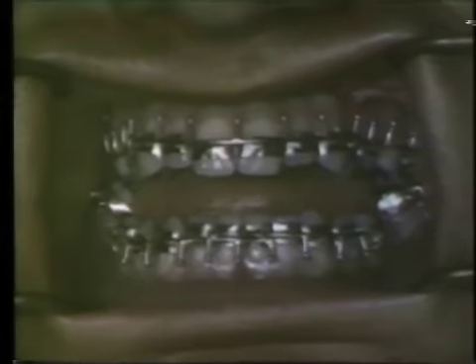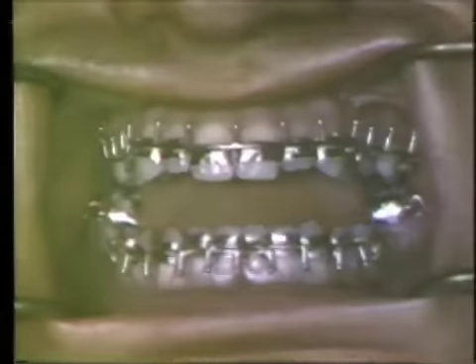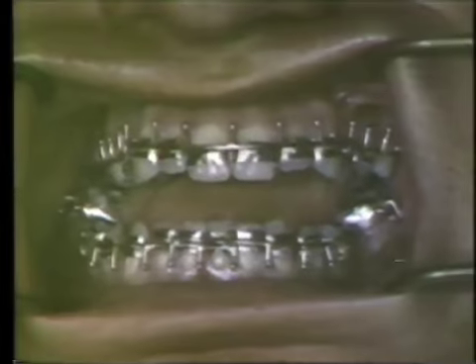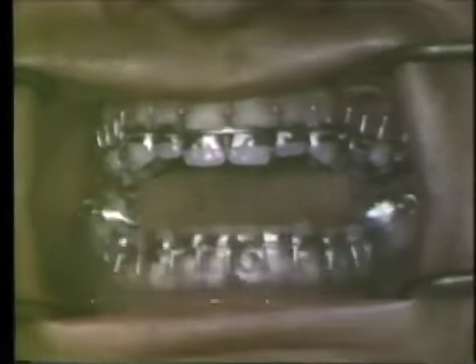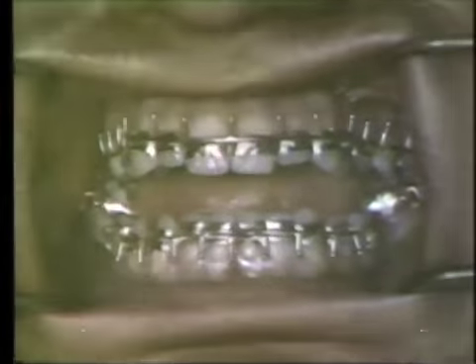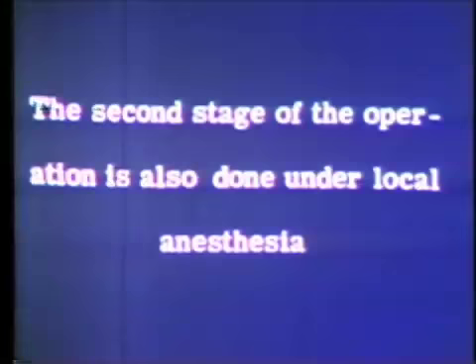We now see, in this instance, orthodontic appliances that utilize banding of individual teeth and a heavy arch. The healing is complete intraorally, and we'll now proceed with the second phase of the operation.